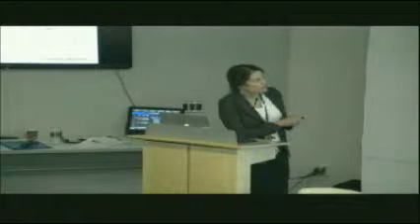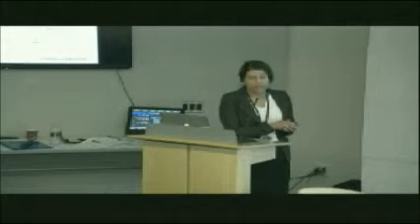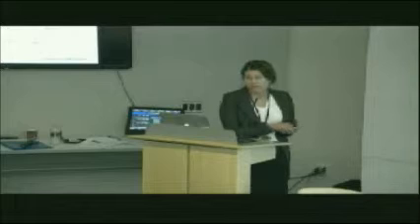The important thing is you stimulate up here, but what you're really measuring is the output. Again, that's what's important, right? How well can we use our limbs? And so what we measure out here is called a motor evoked potential, or an MEP. And I'll keep coming back to that, because that's our measure that this stimulation did something. How well did it get down to this muscle of interest down here?